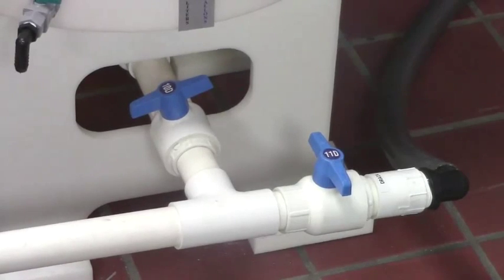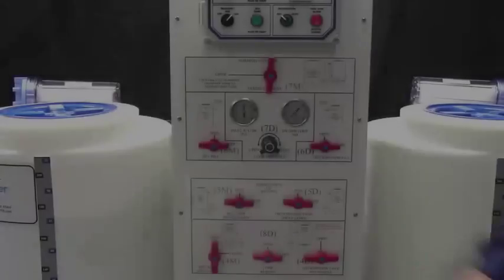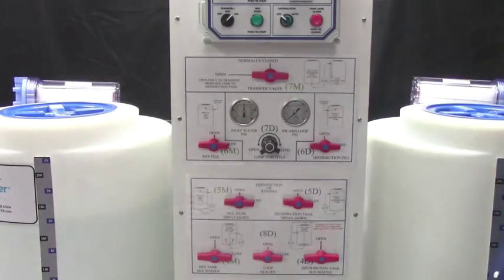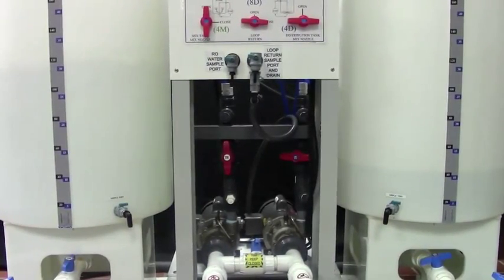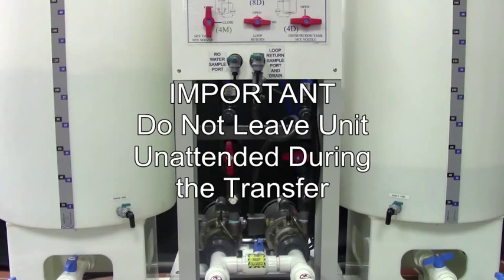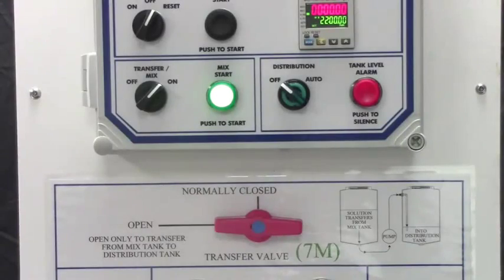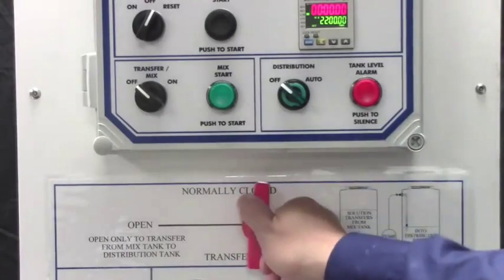Make sure valves 11D and 10M are closed. Open 7M, close 4M, and push the mix start button. The solution is now being transferred to the other tank. Do not leave the unit unattended during the transfer. Allowing the system to run when the tank is empty will damage the pump. When the transfer is complete, turn the transfer mix switch off and close valve 7M.